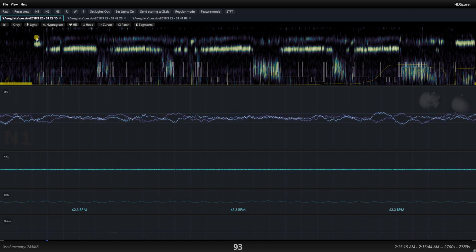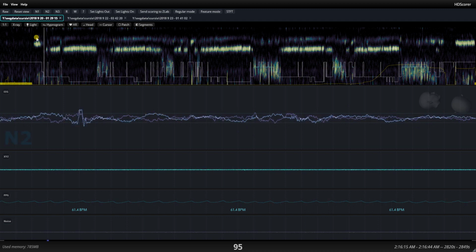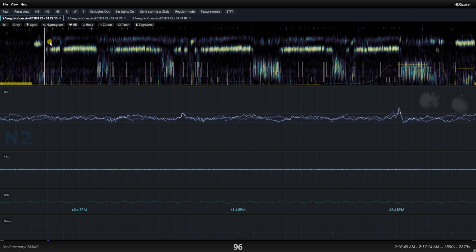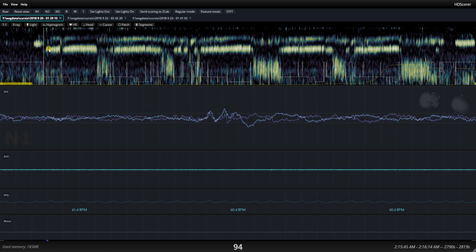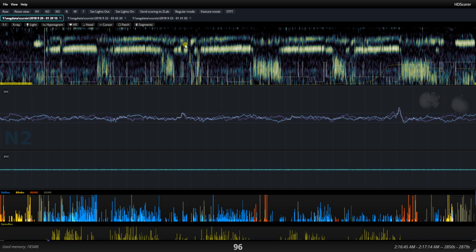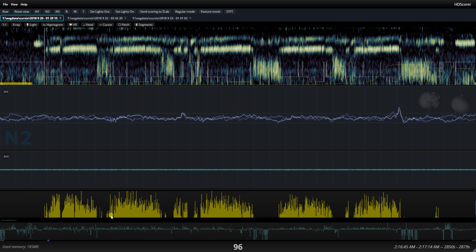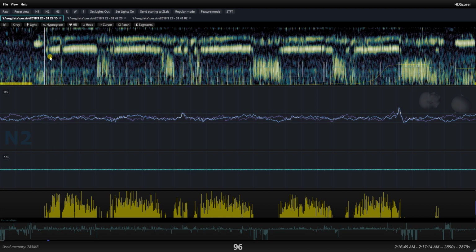Here we have N1 in correspondence with slow eye movements. And then we go to N2, because even though they're a little bit too light to see, the spindles actually begin here, even though they're pretty weak. You can confirm that by going into the features, and here you've got what I call the spindle envelope, which is simply this yellow wave here. This shows the spindle activity. So the onset determination was absolutely perfect, spot on.